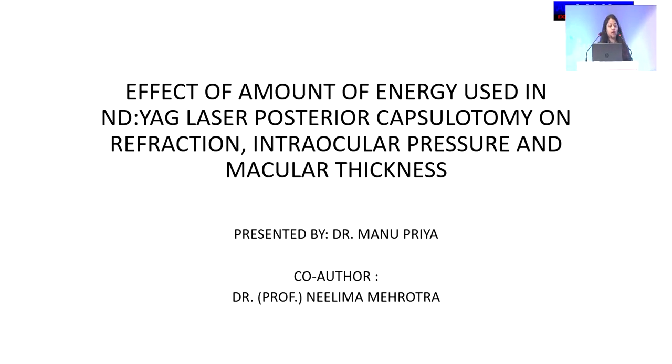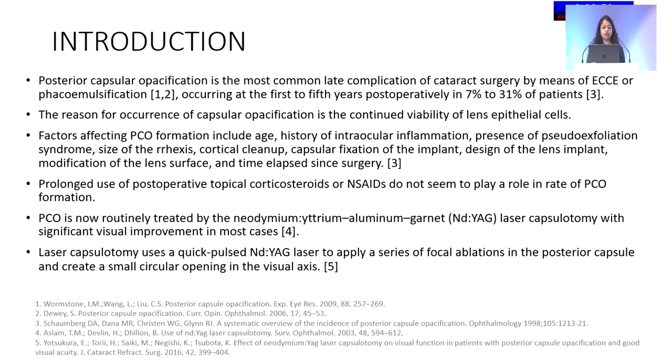Good afternoon, everyone. The topic for my presentation is the effect of the amount of energy used in ND-YAG laser posterior capsulotomy on refraction, intraocular pressure, and macular thickness. Posterior capsular opacification is the most common late complication of cataract surgery by any ECCE procedure. It can even be per-operative PCO, but it usually occurs between the 1st to 5th years post-operatively, in about 7 to 31% of patients.